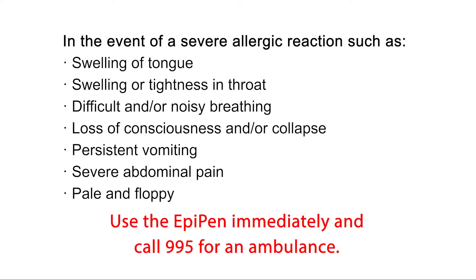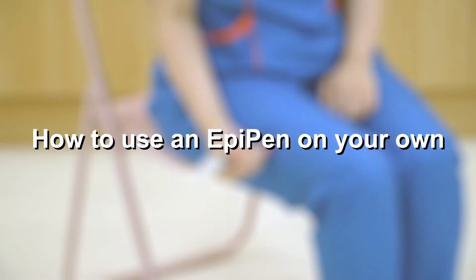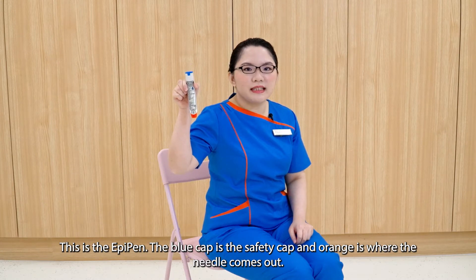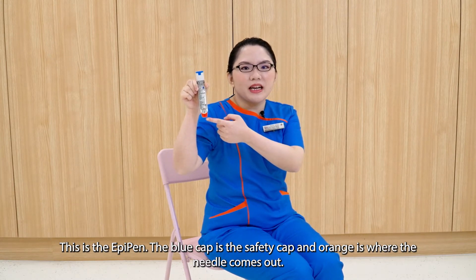Use the EpiPen immediately and call 995 for an ambulance. If in doubt, give the EpiPen. This is the EpiPen. The blue is the safety cap and orange is where the needle comes out.